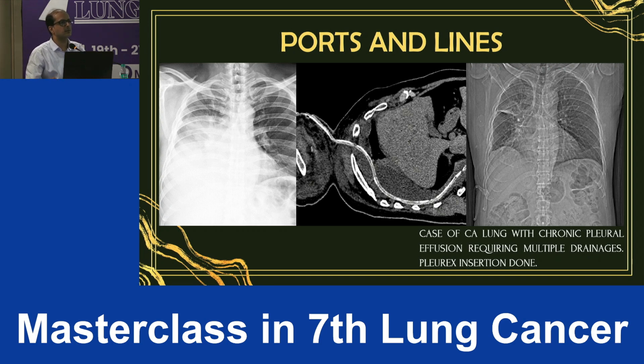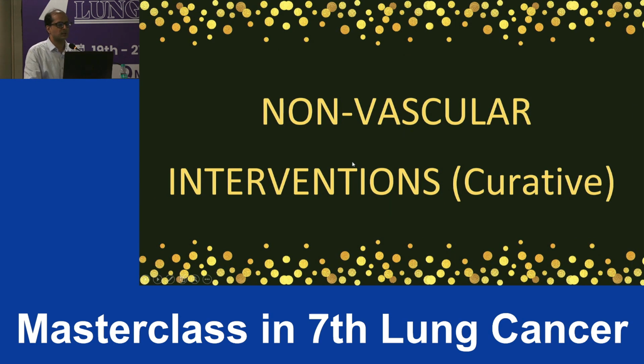At least 1 liter of a sample can be easily collected, so that the patient's visits to the hospital reduce significantly. These are generally terminally ill patients who do not want to come to hospital again and again, and that's where the Pleurx catheter comes into play. And this is a pleural catheter. This is also one of the tunnel catheters which can be placed.